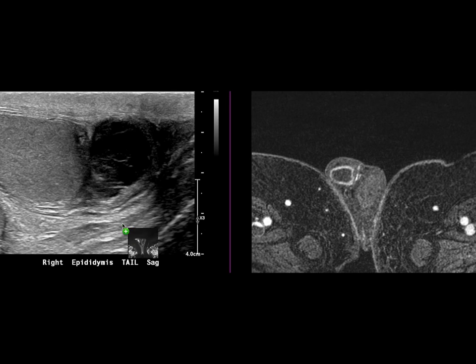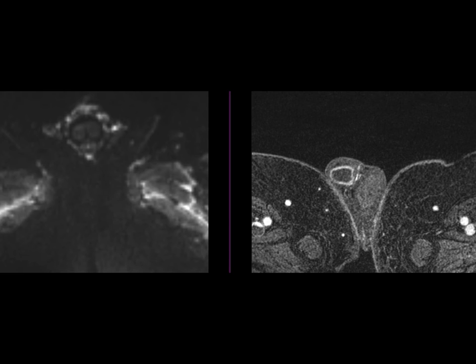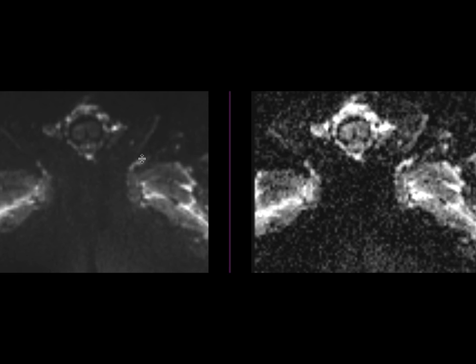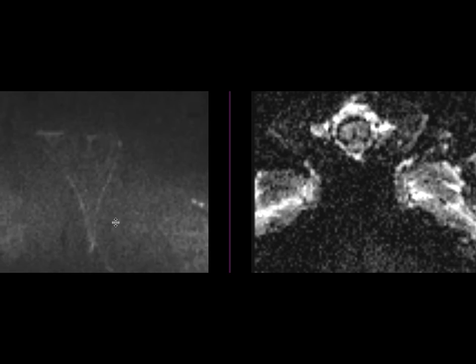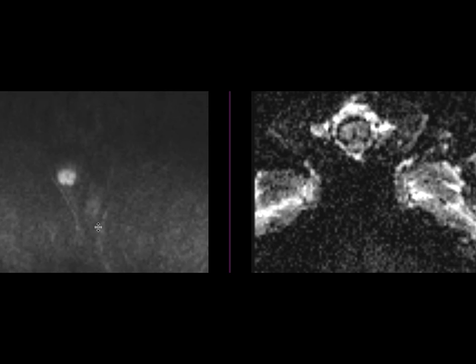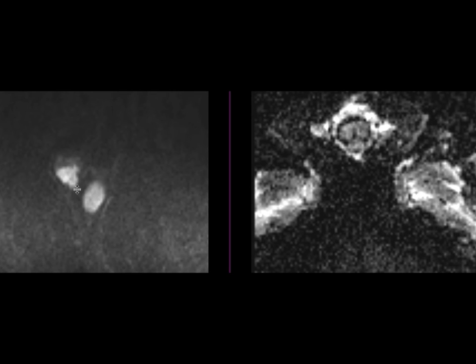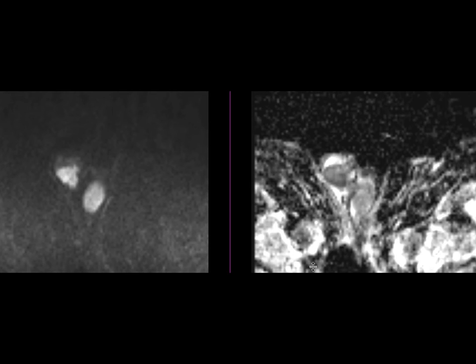We also did diffusion-weighted images in this case. On the high B-value images, the abscess is hyperintense, and it's hypointense on the ADC images, as would be expected for an abscess. This is a nice case of epididymitis with an associated abscess seen on both ultrasound and MRI.